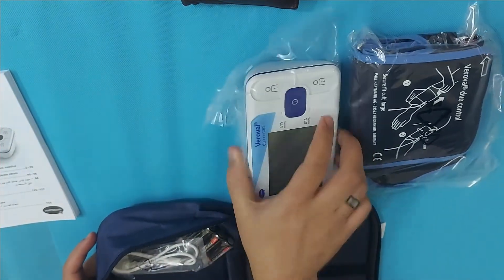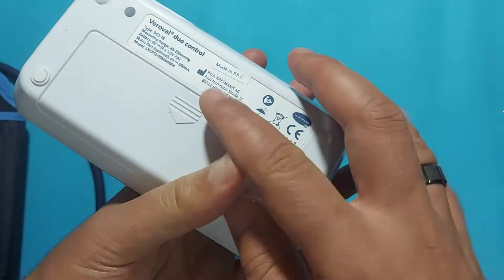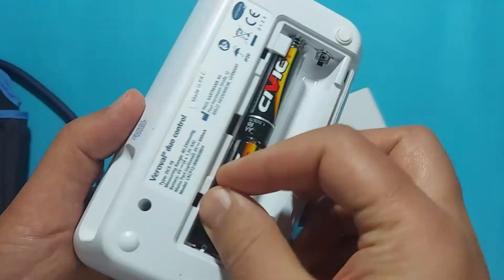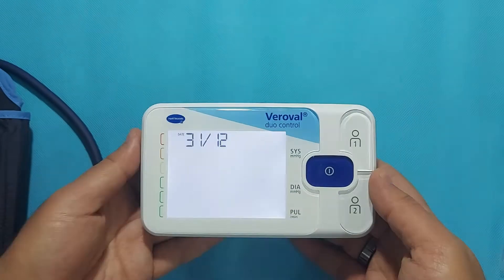A data cable is also included if you want to transfer BP readings into your computer. First, you have to install the batteries in the BP monitor, according to the plus and minus signs correctly.